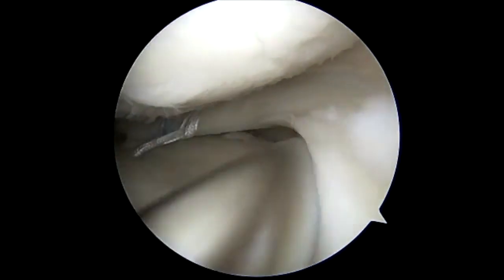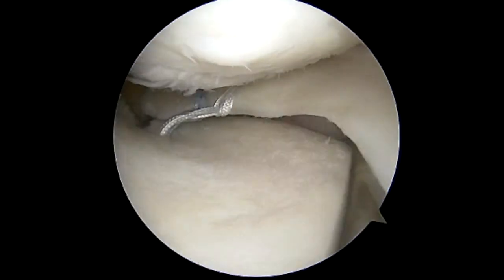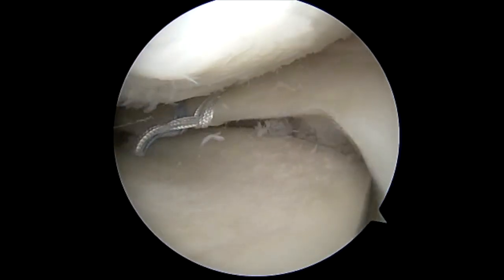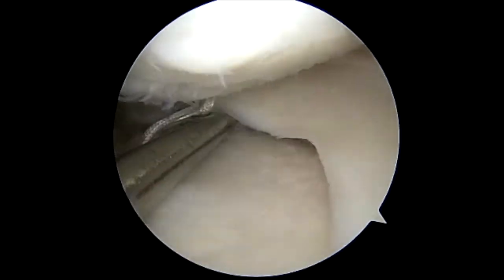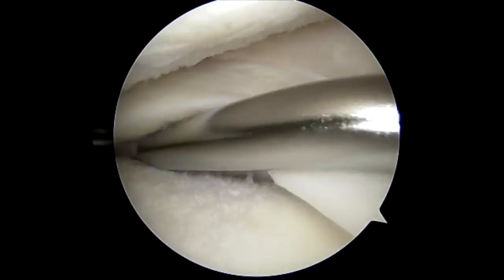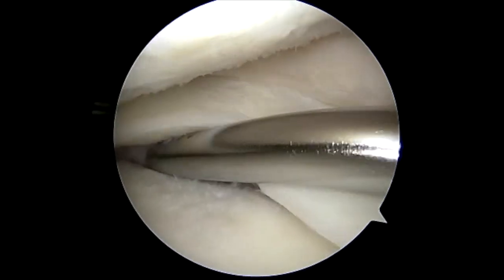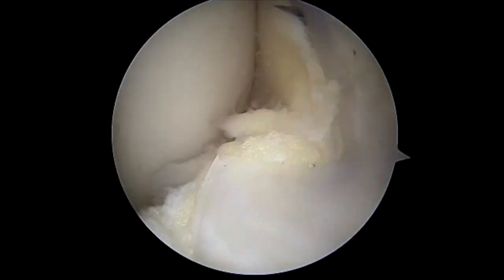We again use a ball rasp. The key here is you need to use this from the opposite portal — we usually work from the medial portal for a medial meniscal root, but here we're working from the lateral portal. We use an elevator to elevate the entire capsule off, then we switch the camera back so you can view that far medial aspect, and we take off the edge of the tibial plateau. This will allow for advancement of the meniscal root and reduce extrusion.